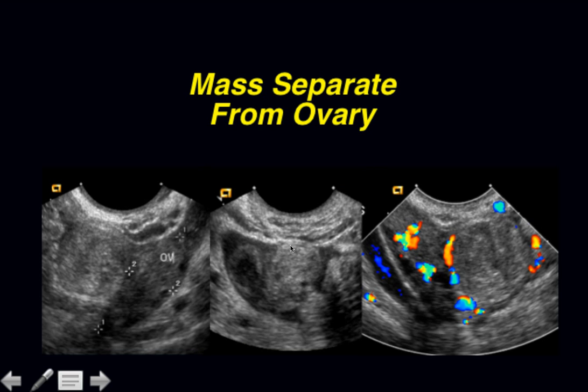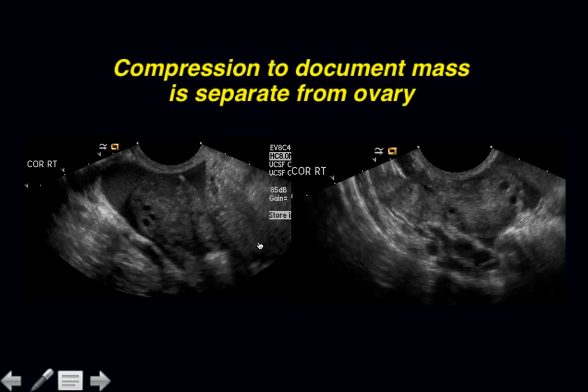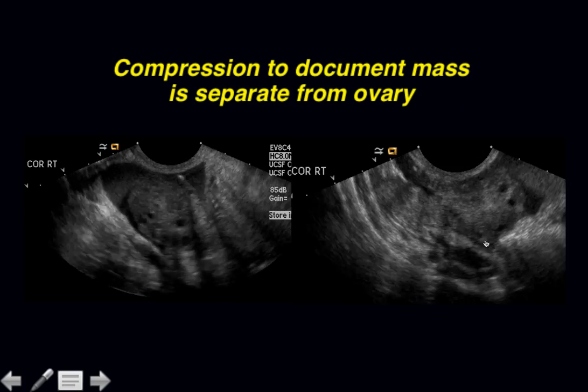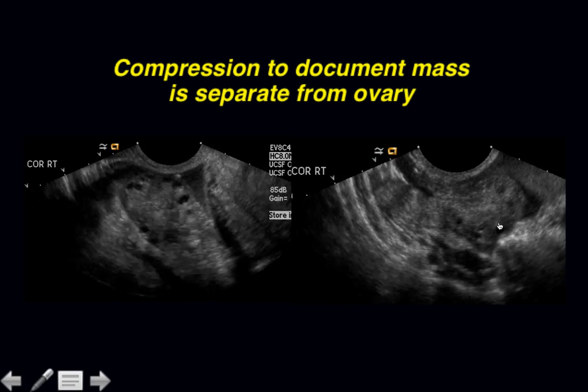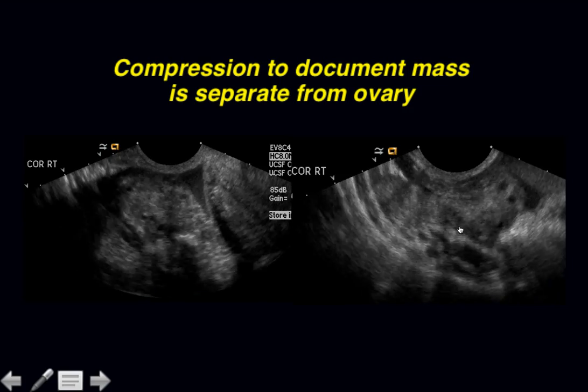Here we can see one of these heterogeneous echogenic masses, and we can see that it is not actually part of the ovary. It lies adjacent to the ovary. One of the things that we can do to show that a mass is separate from the ovary is to employ compression. This works in a very high percentage of cases, and I use it very extensively. So this mass clearly moves in a different way than the ovary moves as compression is applied with the transducer. So echogenic fluid and an echogenic mass.